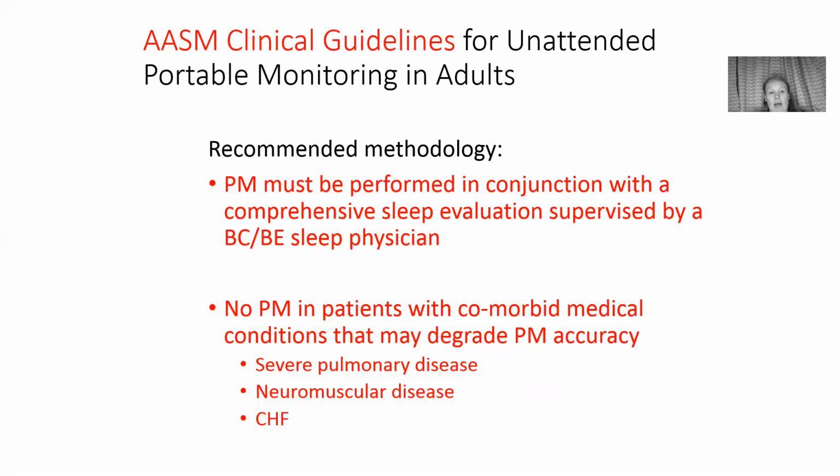That's a board certified or credentialed sleep physician. No portable monitoring in patients with comorbid medical conditions that may degrade portable monitoring accuracy. Some examples of this are severe pulmonary disease, neuromuscular disease, or congestive heart failure.